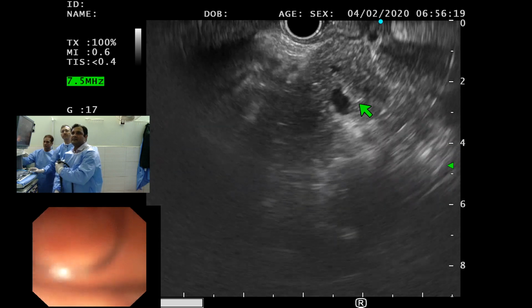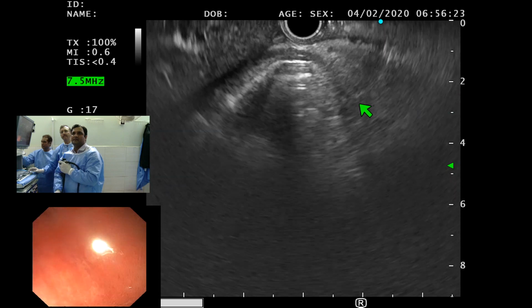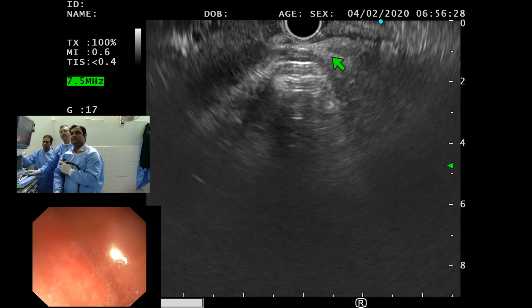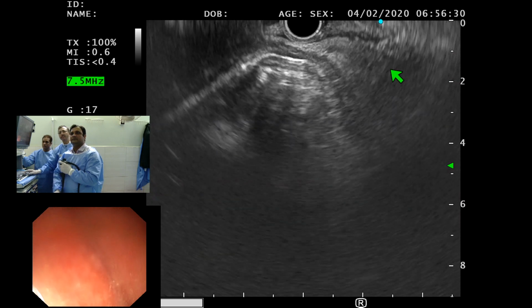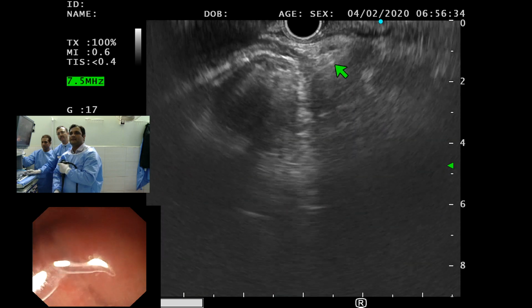Go back, because basically we are interested in the lower end of the CBD. Now you can see things better. Yes, good. Trace it all the way down to the head of the pancreas.